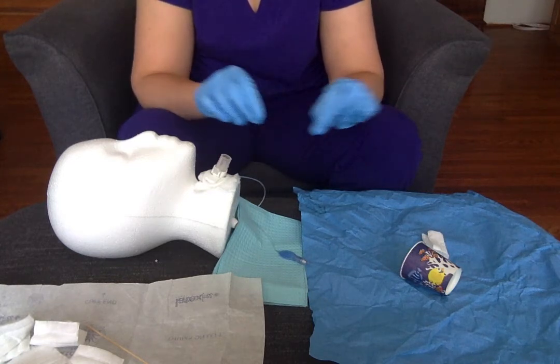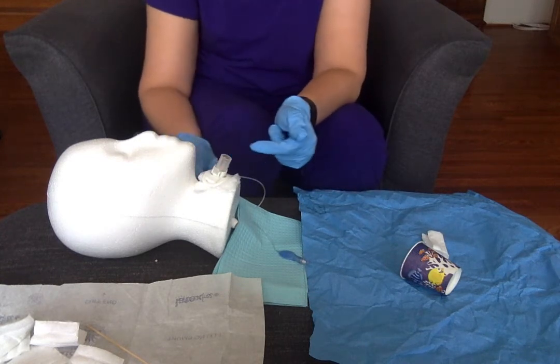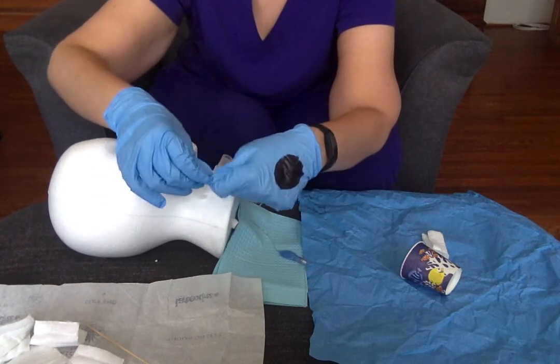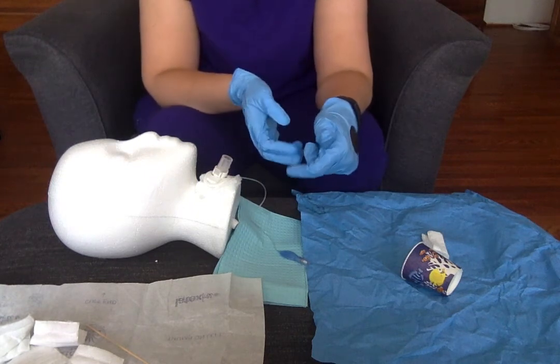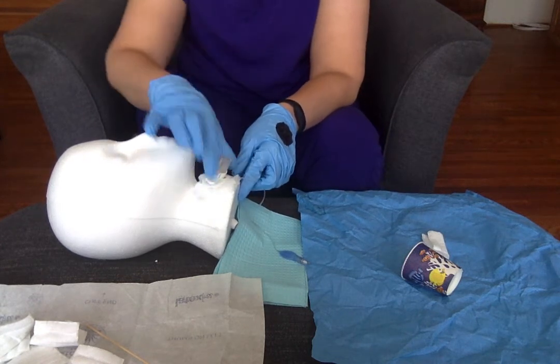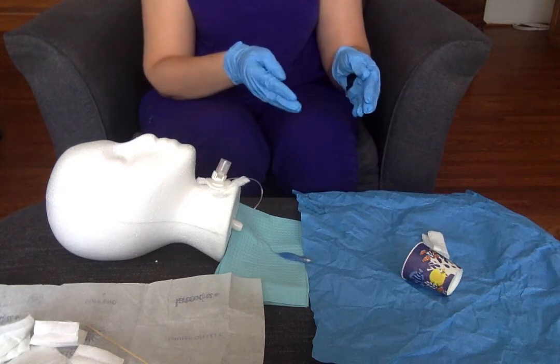Now I want to take the trach ties. What you guys have in your kits are those long ribbons — sometimes they have Velcro ones where you slide it through and just Velcro it down, which are really nice. For the trach ties, you're going to put one end through here, make sure the ends are even, slide it underneath your patient to the other side, take one side and put it through the little hole, then tie a square knot — right over left, left over right. You want to make sure that you leave two finger widths of space between their neck and the trach ties so we don't cause a pressure injury. At this point, you can go ahead and cut off and remove the old trach ties. We wait to remove them because if you accidentally cut all the ties off and the patient coughs forcefully, the whole tracheostomy tube could come out.